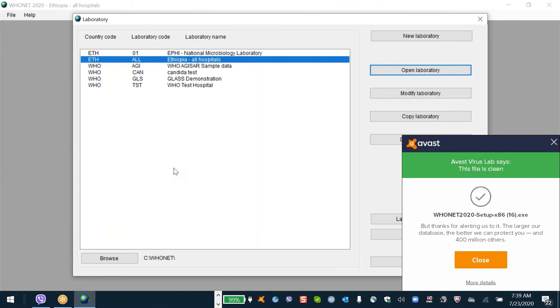So this would be very valuable for you so that you can feel comfortable. What you've been doing previously, I guess, is analyze hospital one with hospital one configuration. Analyze hospital two data with hospital two configuration. Analyze hospital three data with hospital three configuration. But using this one, you can analyze all of the data from any of the hospitals using one configuration. That's more convenient. You can keep the breakpoints up to date because it's just the one configuration. And more importantly, you can analyze all 10 hospitals at once without being afraid of missing antibiotics.